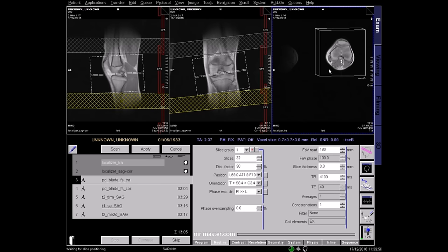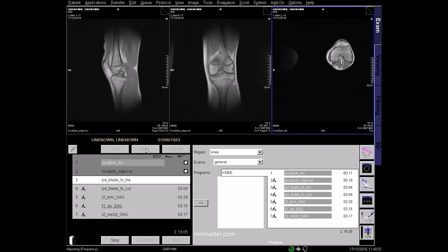Now centre the axial localiser in the field of view. The phase direction in the axial scans should be right to left, to avoid pulsation artefacts from the popliteal artery.